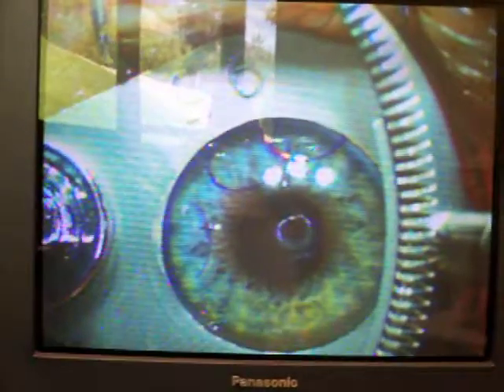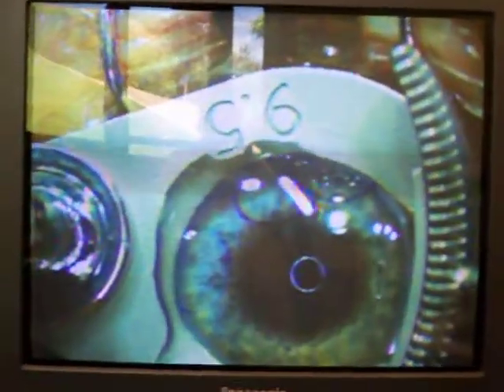What are the dots on the eyes for? Actually, it's an old surgery standby in case the flap were to completely dislodge. It's important that it's oriented the same way, not just put in place. By having those two different dots in different places, you can line those right back up. And the flapper's the thing that they just pull off the eye? That's right. It's creating a flap right now.